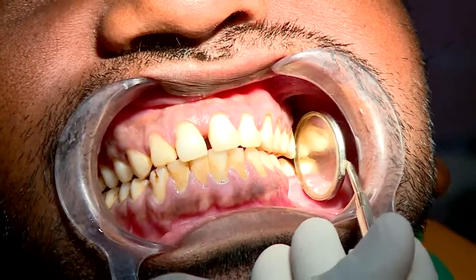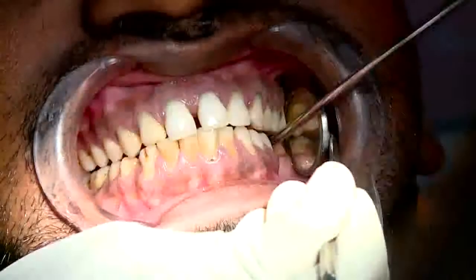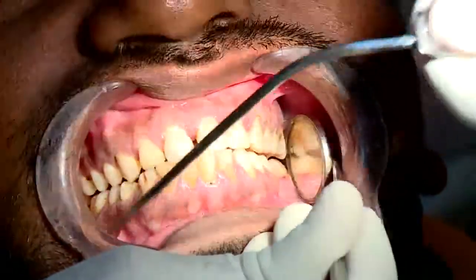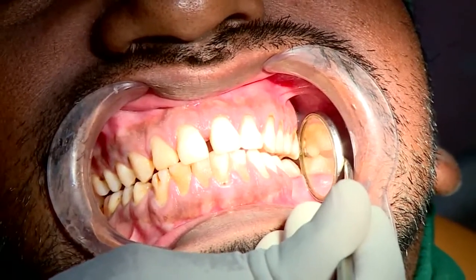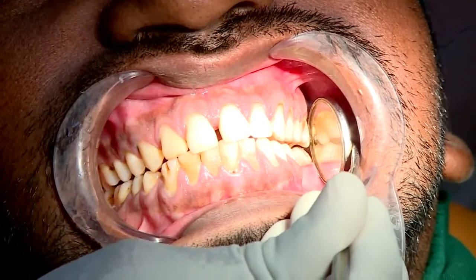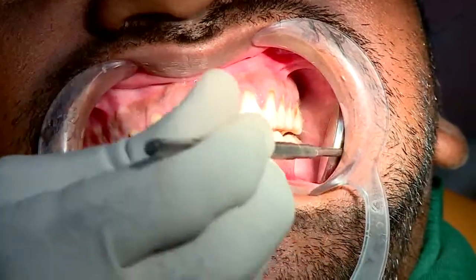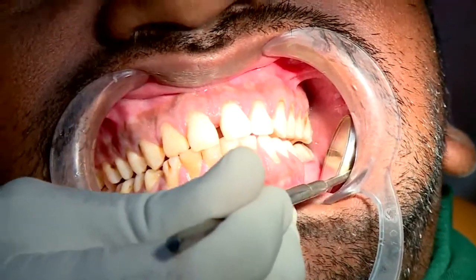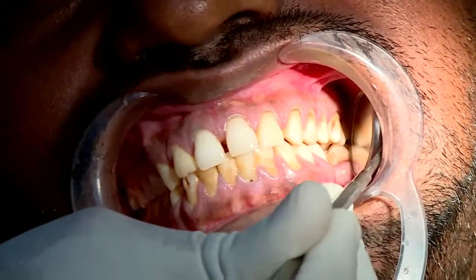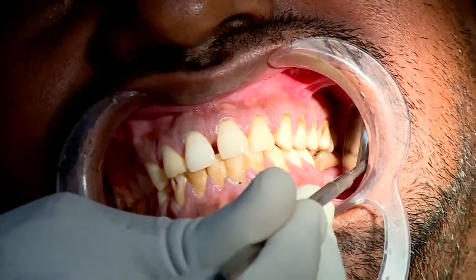This is not like what you say. We have a lot of ideal situations. In fact, this gentleman has got a fair amount of resorption, but we have enough bone in which we can go ahead with the implant. Now we are talking about a buccolingual resorption. Height wise, I think he has got enough here. Is the video capturing that we have space between, the interarch space wise, we do have space.